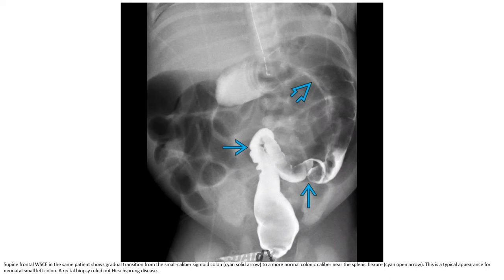Frontal water-soluble contrast enema in the same patient shows gradual transition from the small-caliber sigmoid colon to a more normal colonic caliber near the splenic flexure. This is a typical appearance for neonatal small left colon. A rectal biopsy may be performed for Hirschsprung disease exclusion.